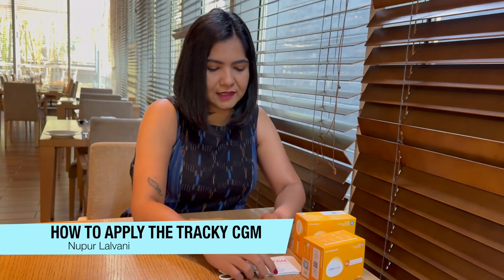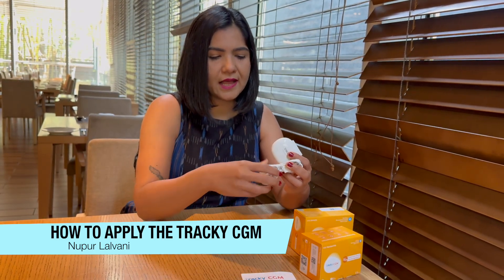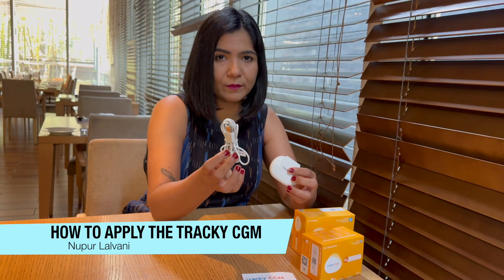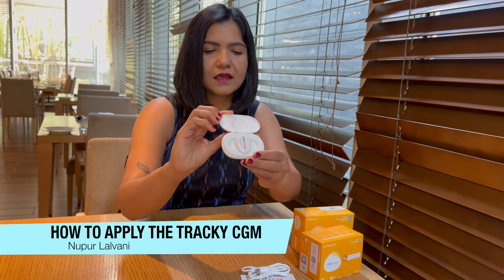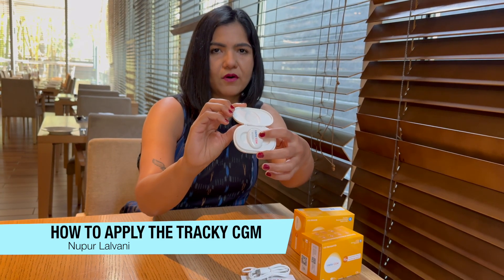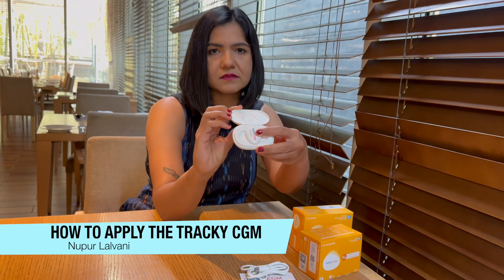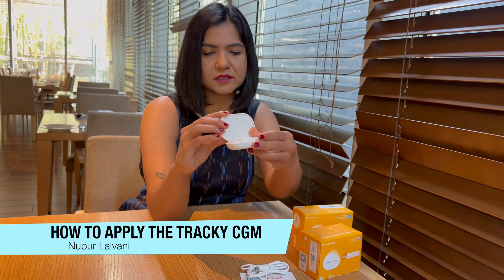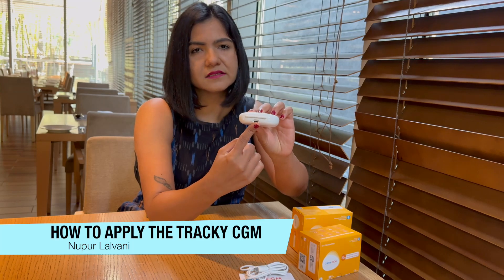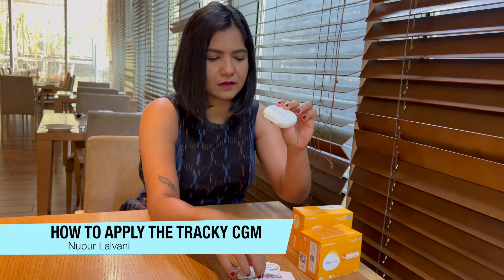As part of the transmitter box, there are three things you get inside. There is the user manual, which is a pretty simple and straightforward thing. Then there is a charging cable — I'll tell you in a moment just why you need it. And then there's this charging unit, which holds your transmitter. This is the transmitter that will sit on top of your sensor. This charging unit has a USB-C facility, which means you can use any USB-C wire or the included charging cable.